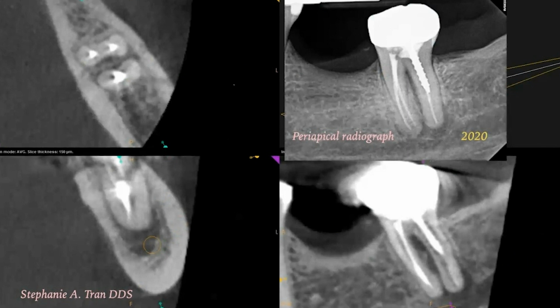And this patient was very, very motivated to maintain this tooth. Additionally, this has to be in line with the restorative treatment planning. So in this case, the patient had a restorative dentist who really wanted to maintain this tooth as well as an adjacent tooth to an implant. Now, because there were no frank signs of a vertical root fracture, again, just because it has a J-shaped lesion does not mean it's automatically a root fracture, we had recommended for this tooth to be retreated.